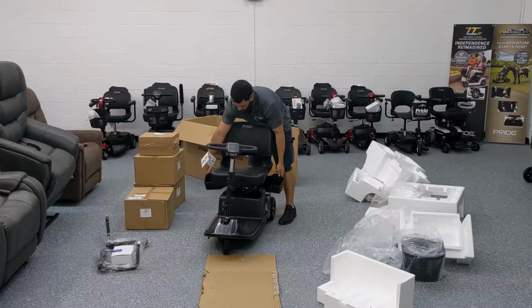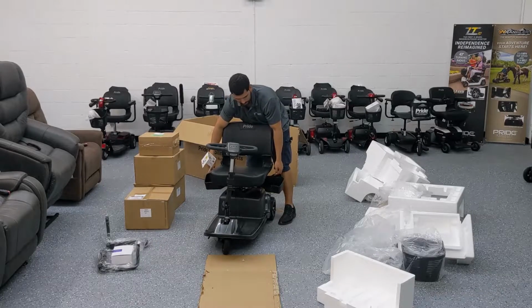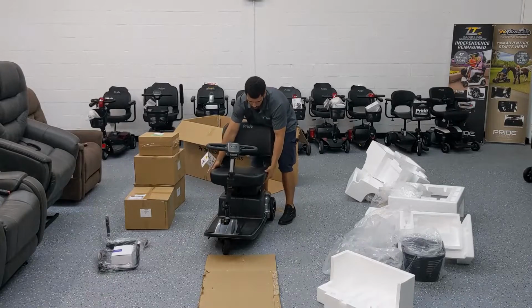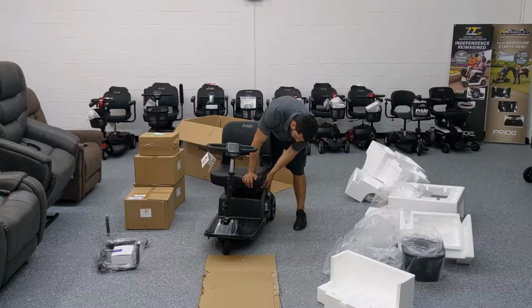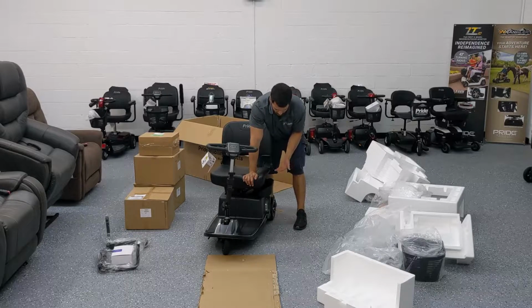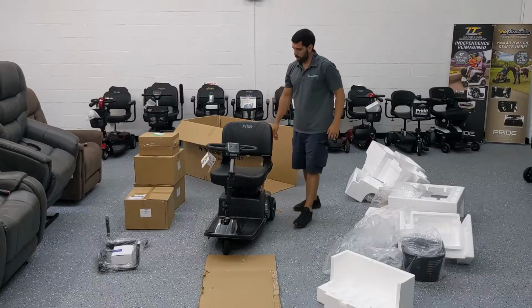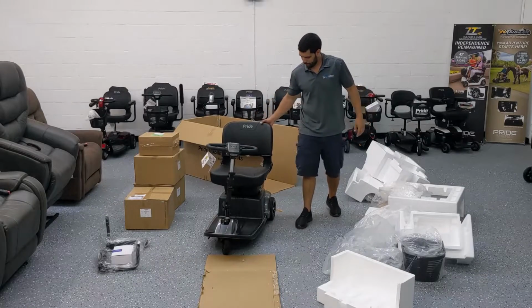So you've got the 2 storage containers here which slide open on each side of the chair. Close them and they click. You want to open them. Takes a little getting used to, but in order to open them, you push up and then pull out. Up, out. So the seat folds. There's a pouch on the back.